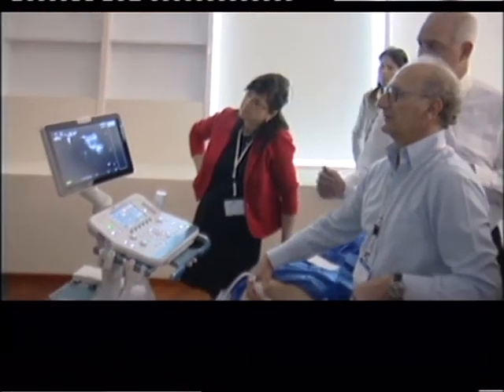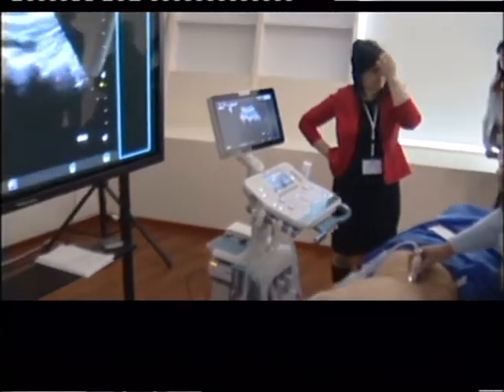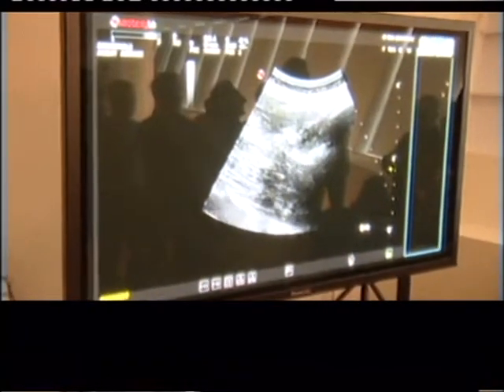Okay, so let's go along axis. Longitudinal way you don't use for the needling? Oh yes, I do. I do longitudinal for facets and for epidurals. This is spinosa, lamina. Here's what's important again. Spinous process. Too many bones. Watch this. You come out.